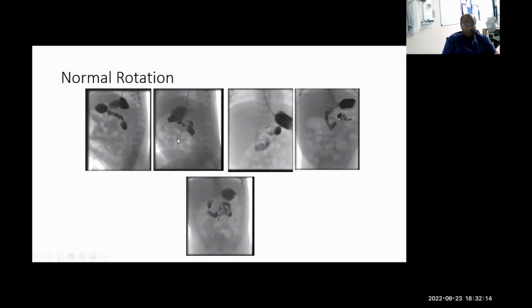So that's the first part. That's the second part. So that's the third part. And then this is the fourth part, which I said would go towards the intraperitoneal cavity. Immediately, I turn the child onto the AP view.